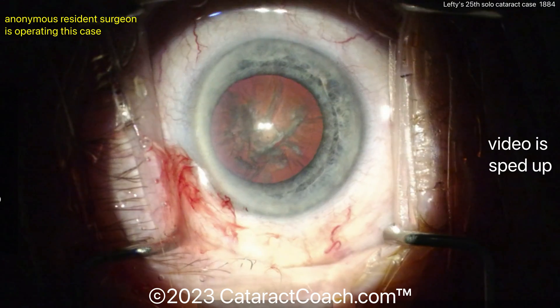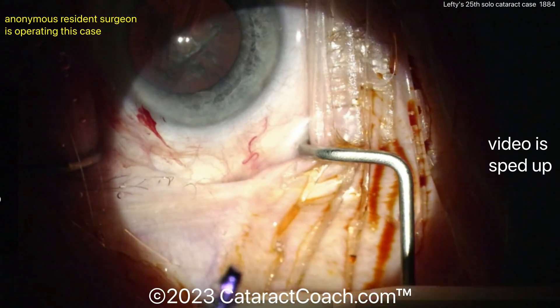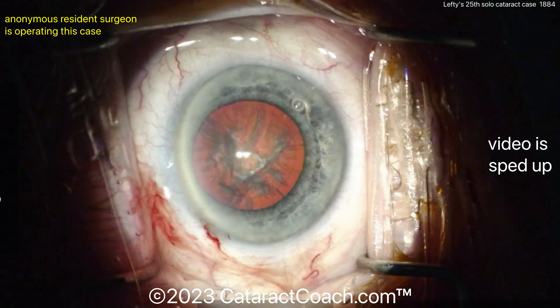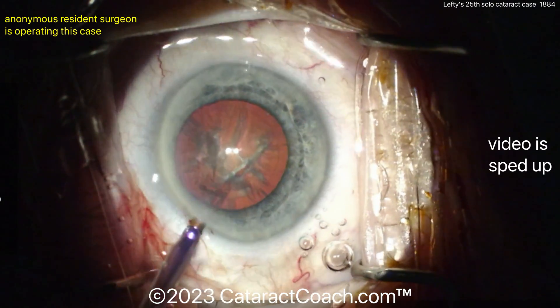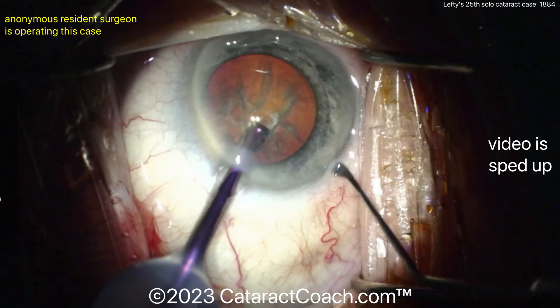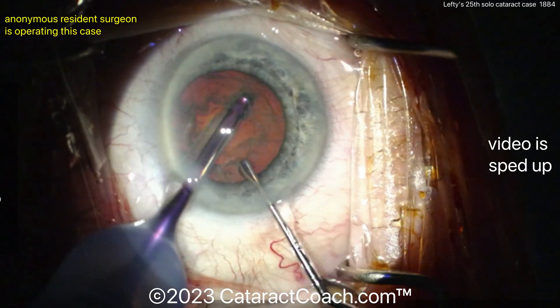Here's the phaco probe — that's going to be in the left hand. Let's see what's going on in the right hand; hopefully a chopper of some design. Now, 25 cases in, I like that you're spending the extra time adjusting the tip to make it the way you'd like it. Your scrub tech is great, but he or she does not have the benefit of using a microscope to see these fine details — sometimes it's hard to see, especially if you're presbyopic. Now, struggling to get the instrument in the eye — use some counter-traction. Hook the para with that chopper, or what looks like a paddle of some sort, and that'll help give you counter-traction. Probably going to be a groove down the middle because you have that paddle instrument in the other hand.